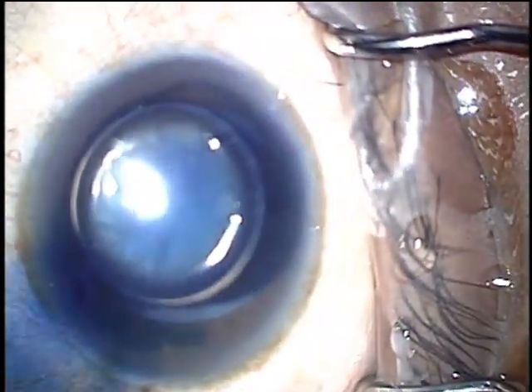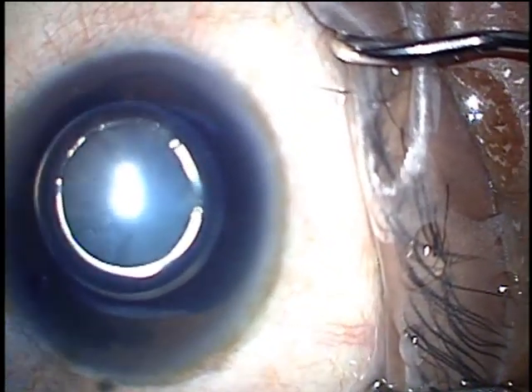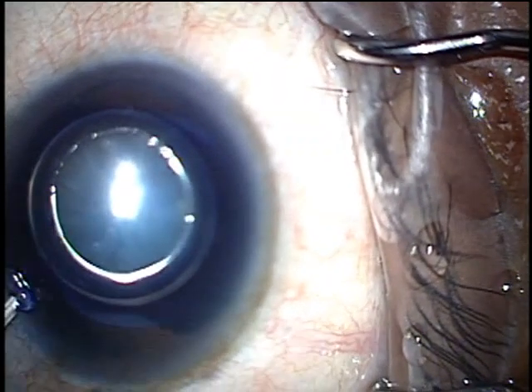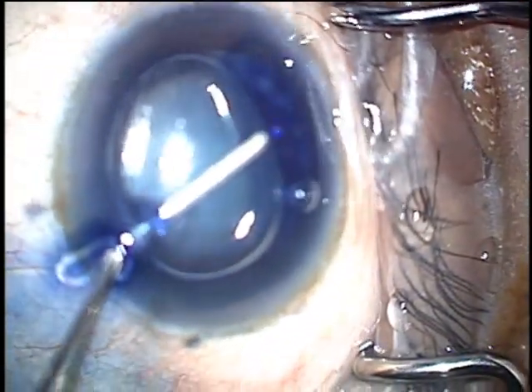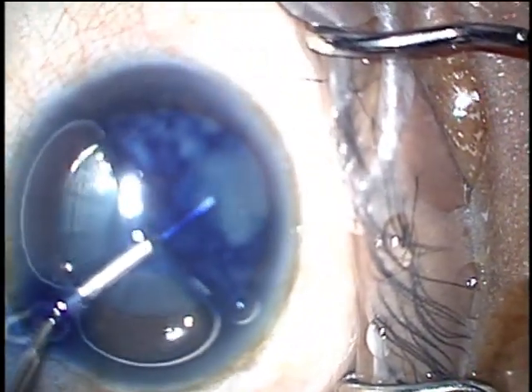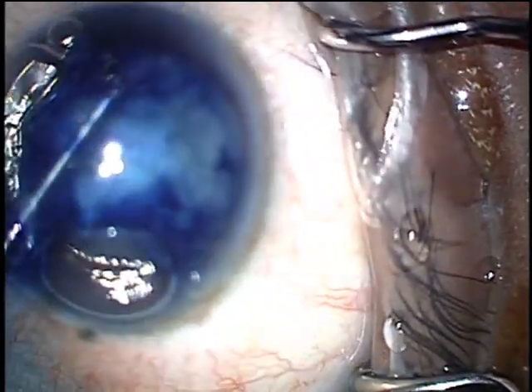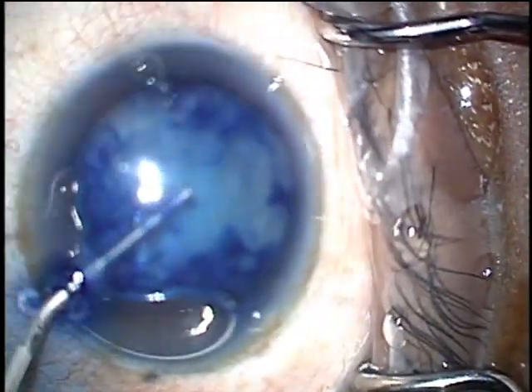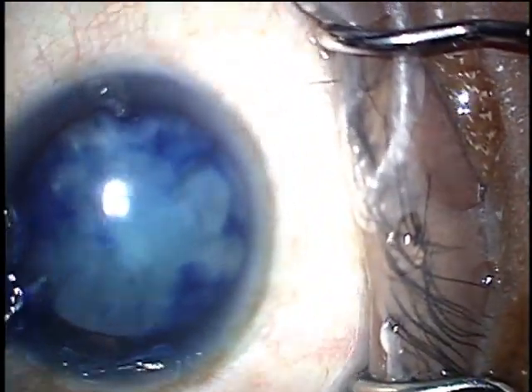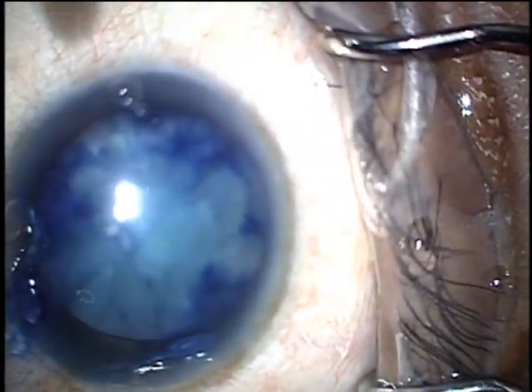You can then just irrigate out the VisiBlue or just replace it with your viscoelastic. I like to use Helon 5 because it's very cohesive and dispersive, and therefore it's not going to burp out of your eye very easily and it will tamponade the anterior capsule. Once the chamber is filled completely and the eye is relatively firm, you want to go ahead and make your standard clear corneal incision.